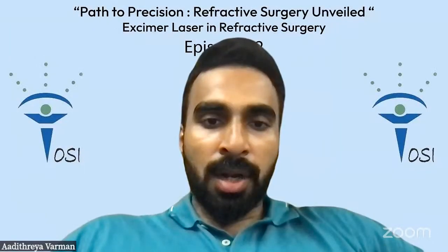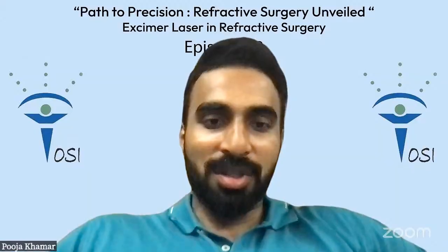I think that's where your adaptive optics has to come in and help us choose. Exactly. So there's a very nice paper on adaptive optics on presbyopic patients, where the spherical aberration change should not be more than plus 0.4 or 0.5. If your spherical aberration change in any of the presbyopic patients is going to be more than 0.5, those patients are not going to be happy because they lose the depth of focus.